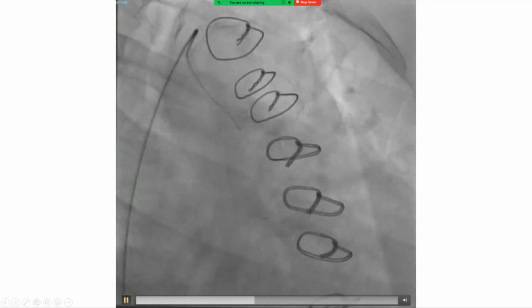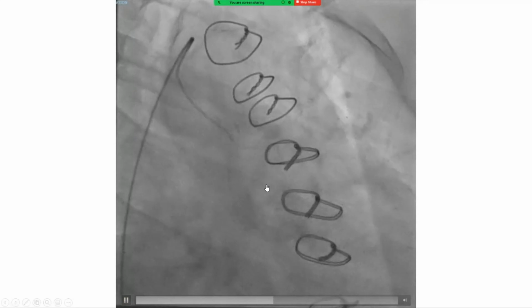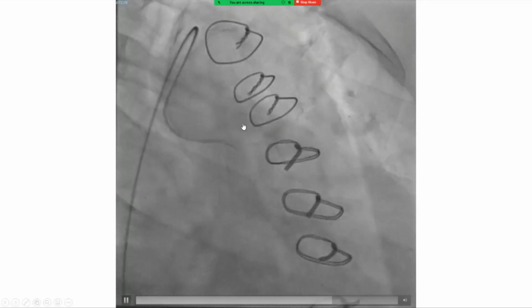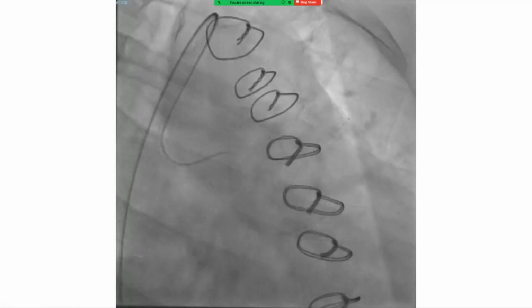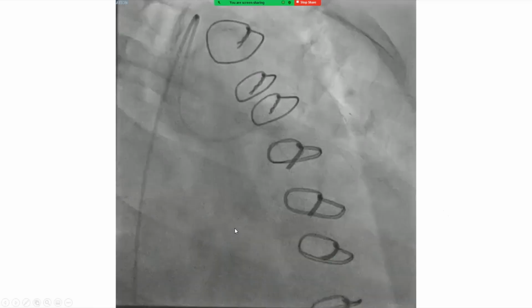And here, once we hooked it, we pushed it to give it a duck shape and to make it point up and be coaxial with that upward looking left vein graft. This is again, after it hooked it, we pushed it. We really want AL2 in vein graft because you want a size big enough to abut the opposite ascending aorta and give you support, left vein graft being a difficult intervention requiring a lot of support.